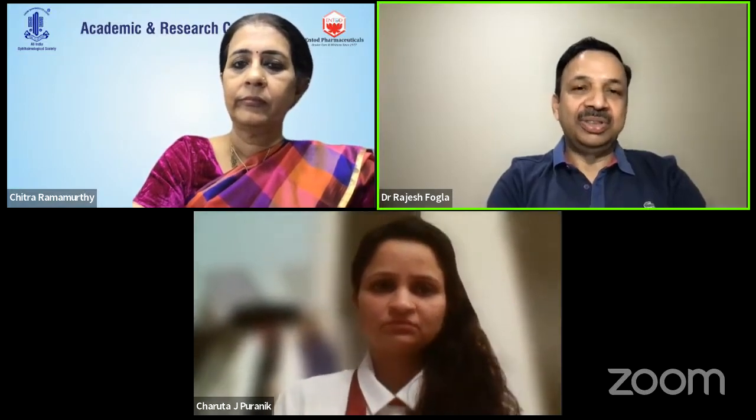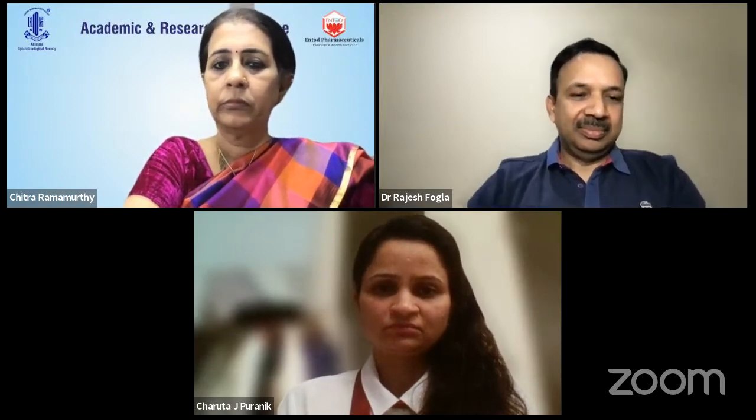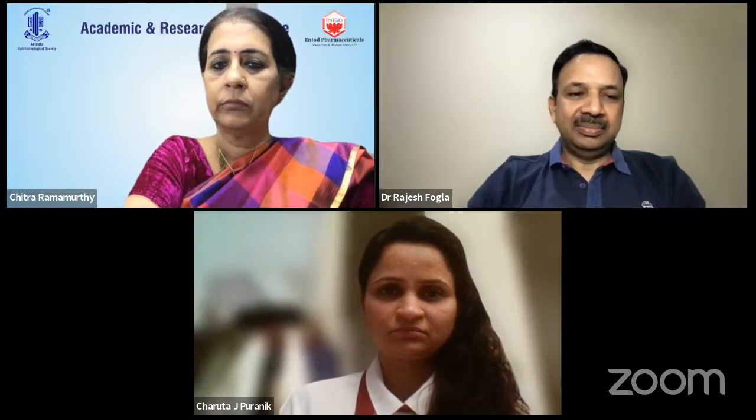And I'm sure Namrata can share, having the intra-op OCT integrated into your microscope plays such a big role in a lot of surgical situations as well. Yeah, I think it was very nicely covered. The whole talk covered almost everything. In acute hydrops, it plays a very important role because you can drain intrastromally also the fluid. In posterior keratitis, it plays an important role because you can see the posterior corneal abscess and whether it is active or not.